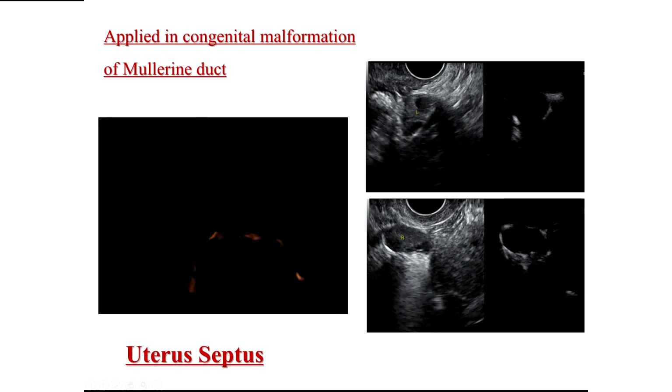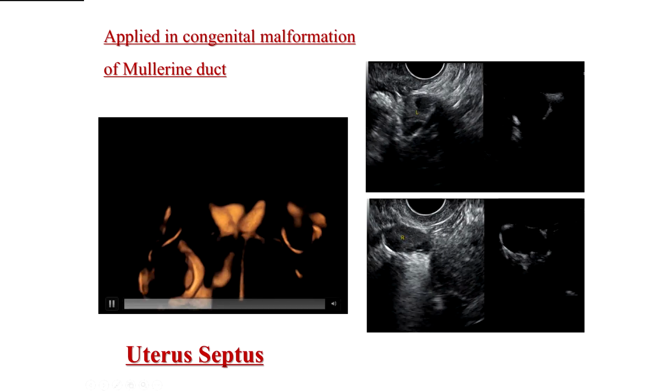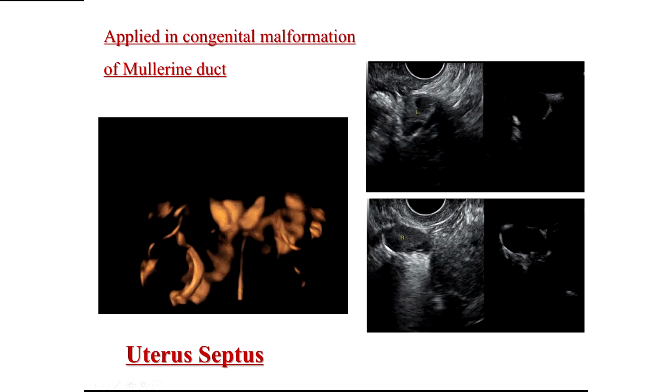For patients with Mullerian duct abnormality, it's difficult to get a very good image of the hycosy. This patient is very lucky because the sacculus was placed right on the bifurcation of the two cavities here. So we can take a very good image of the two cavities and the two tubes on both sides. And in this patient, the tube is patent. And for the unicornuate uterus, the image is very typical. For this patient, we can see a bunch of contrast agent present initially.